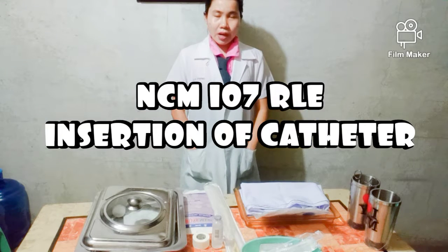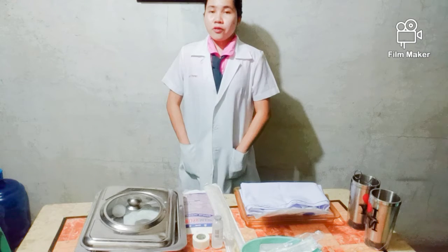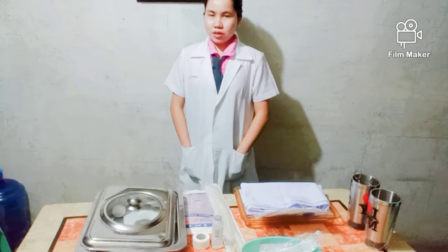Good day everyone. I'm Alasa Chichi from BSN2B, and today I will be performing the female urinary catheterization.